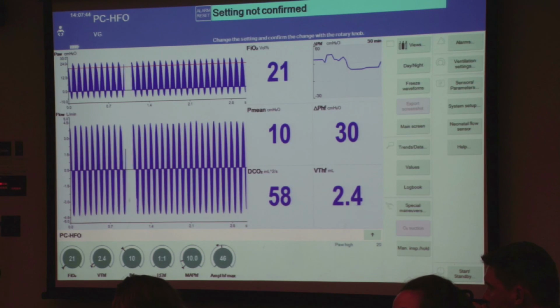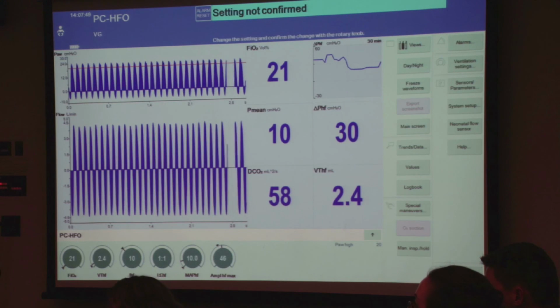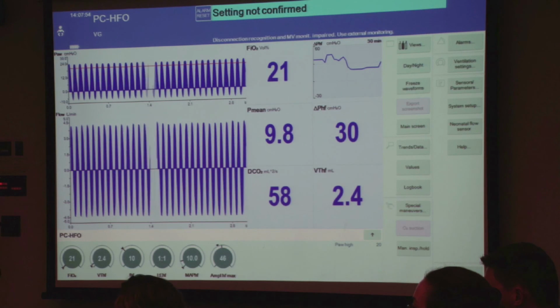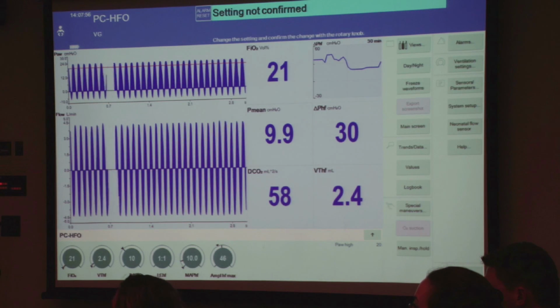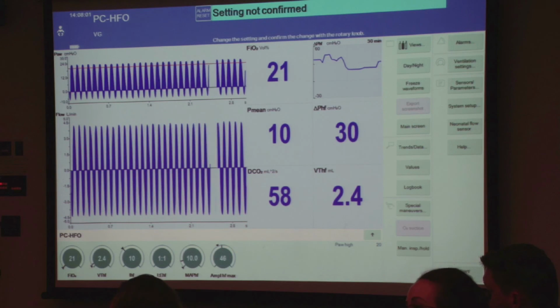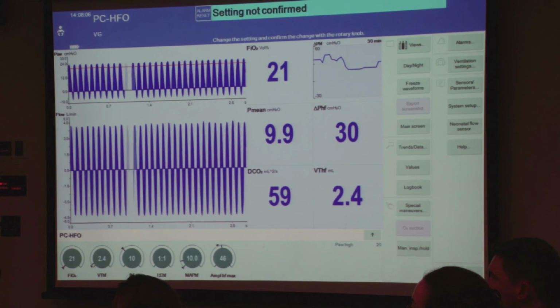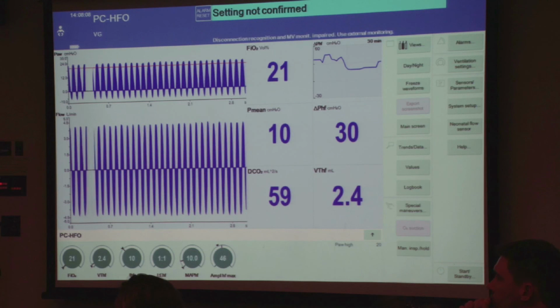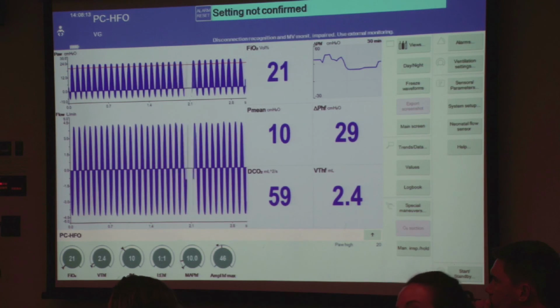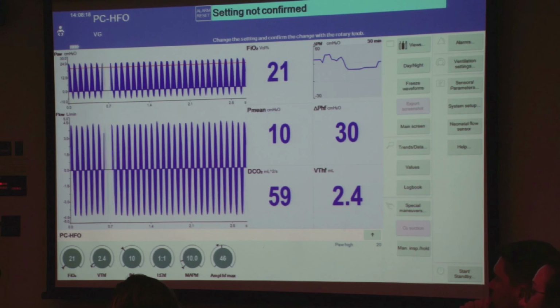Yes, but I think that's in relation to the oxygenation, obviously. And that doesn't change. I think that's no different from what you're currently doing with the SensorMedics. I think the big difference with the SensorMedics is not in the oxygenation part of it, but in the ventilation part of it. I think that's where this ventilator actually shines, at least in my opinion, because it's more efficient in many ways. Or not more efficient, but it tells you more about what's happening really in the patient.